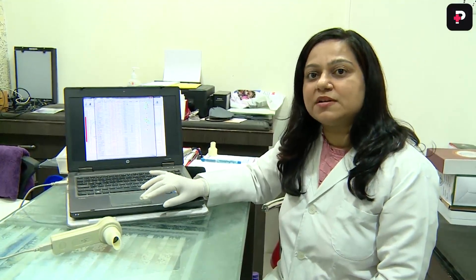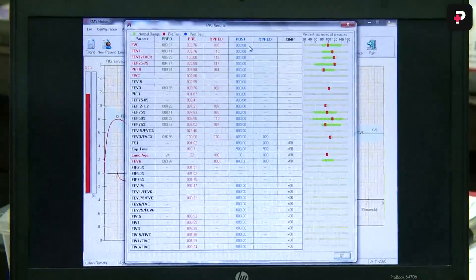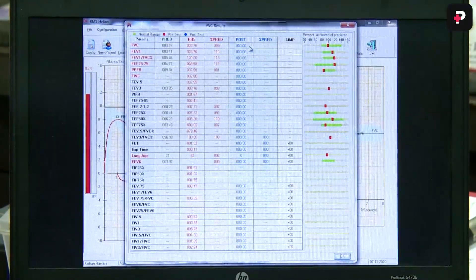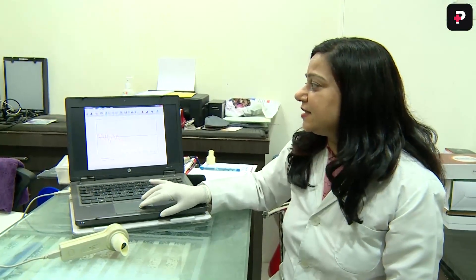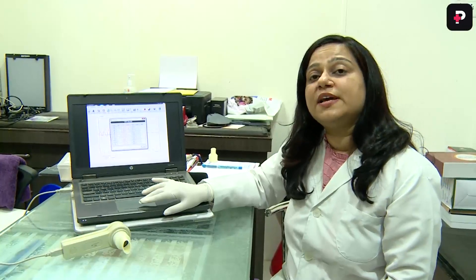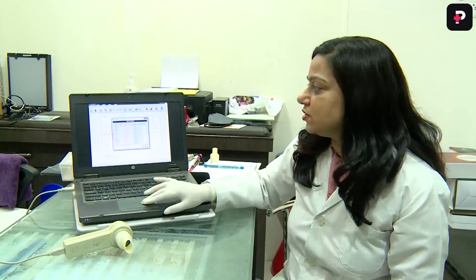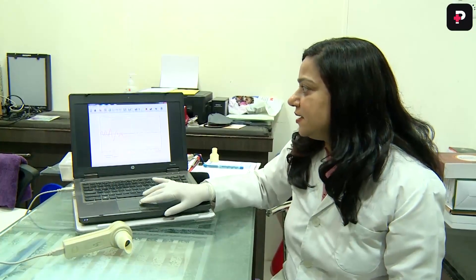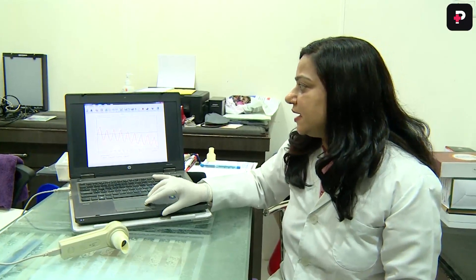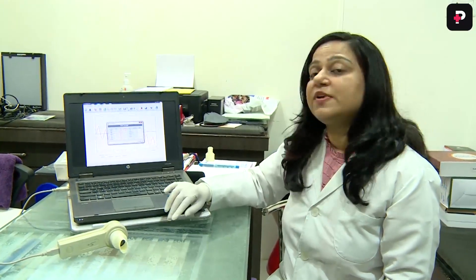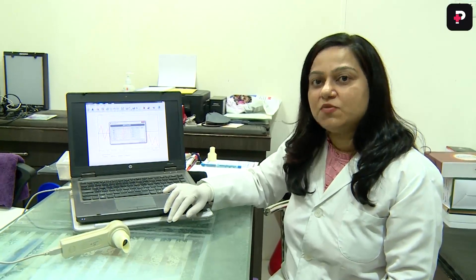You will get all the parameters related to forced vital capacity on the screen. Then click on SVC and then click on Result — you will get all the parameters related to slow vital capacity. Then click on Maximum Voluntary Ventilation and click on Result to get all the parameters related to maximum voluntary ventilation.